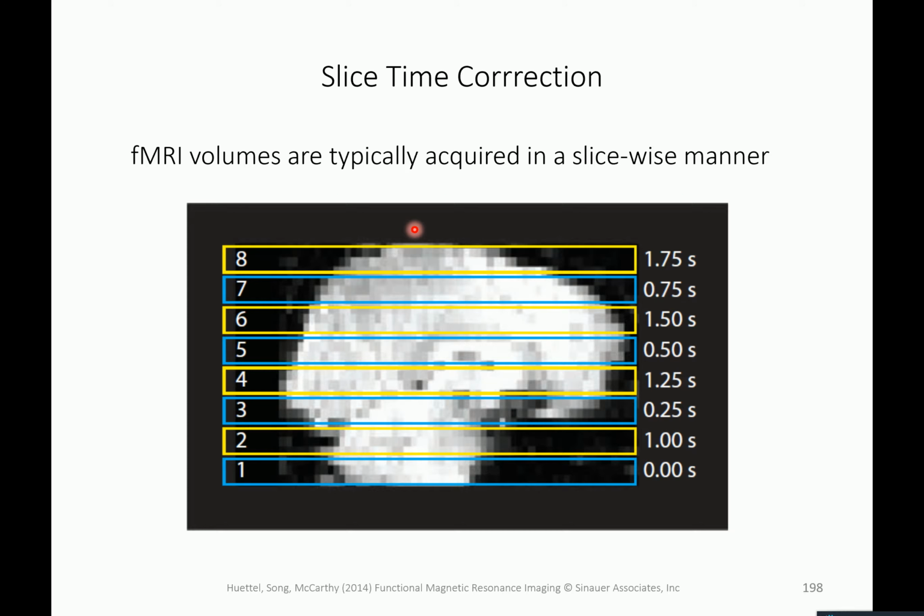Are there devices which excite different slices at the same time? Yeah, that's what I meant by one-shot imaging. In a way, it's not completely different, because then you have just a thicker slice. So you can also excite the whole thing and then do 3D Fourier transform imaging to get the spatial information out of it.